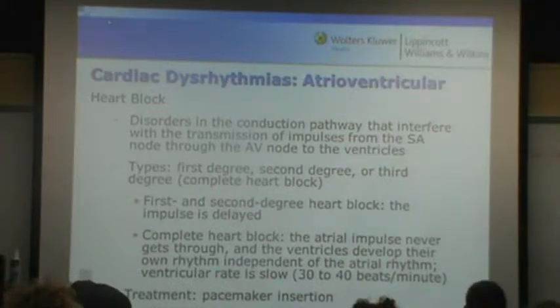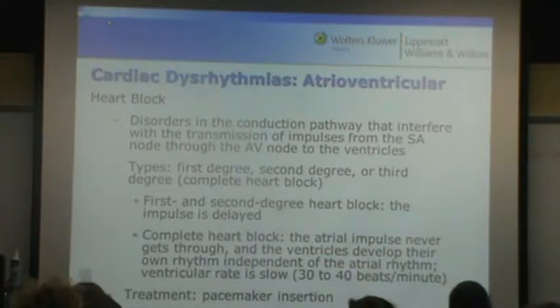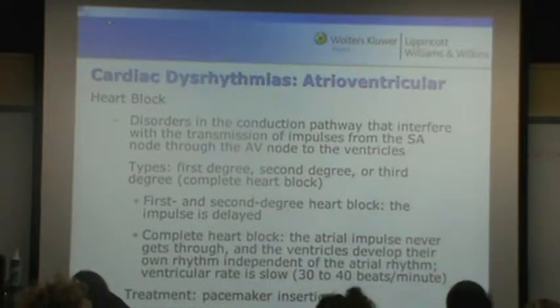All right, so write that one down. Okay, what do we have? Heart rate's 47. All right, so right off the bat, we know it's slow. Right. So, do we see P waves? Yeah. Are P waves all normal and upright? Mm-hmm. When we look at that PR interval, it looks good. It's not delayed, and it stays the same. Okay. There's a QRS after every P wave, all of that good stuff.